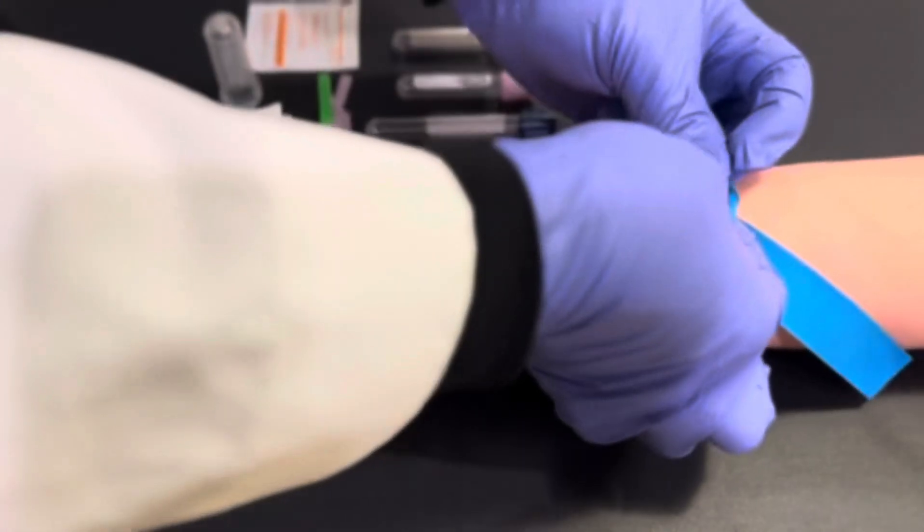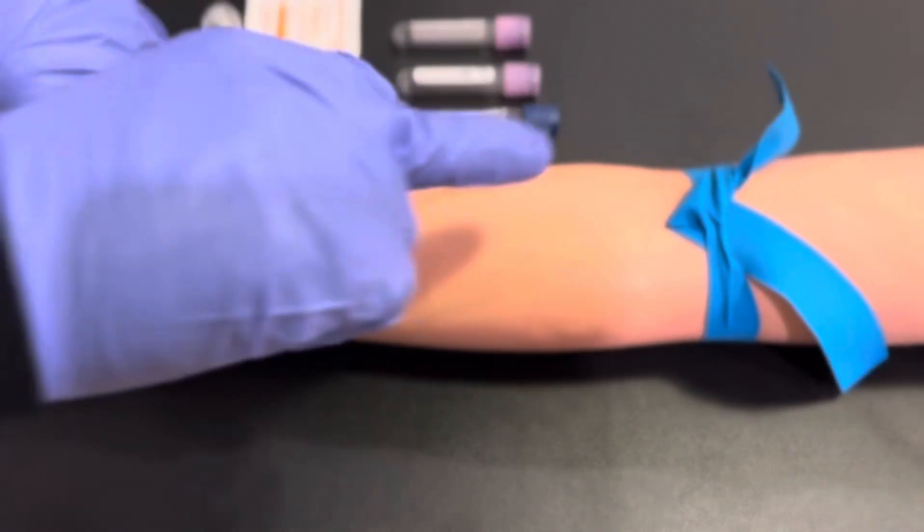First, you're going to apply your tourniquet at the antecubital fossa, focusing on the three primary veins.